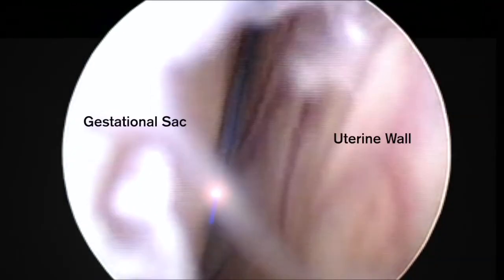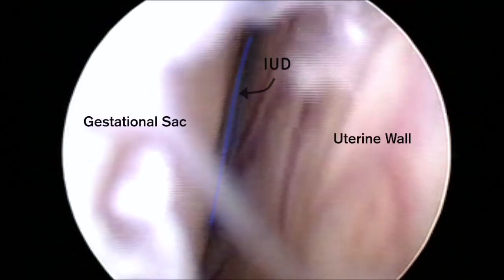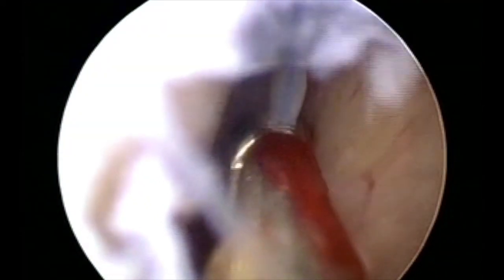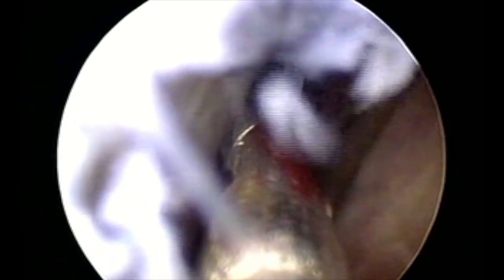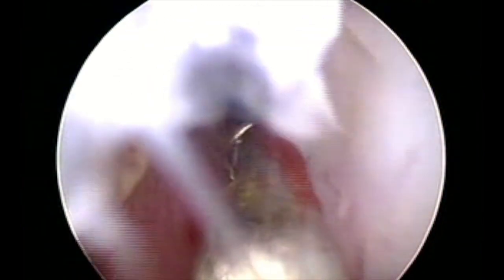The IUD is located and, using the hysteroscopic grasper, the IUD is grasped firmly and slowly removed. It is kept in view as the hysteroscope is removed from the uterine cavity and endocervical canal.